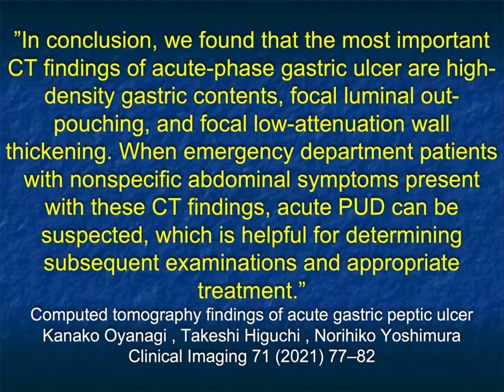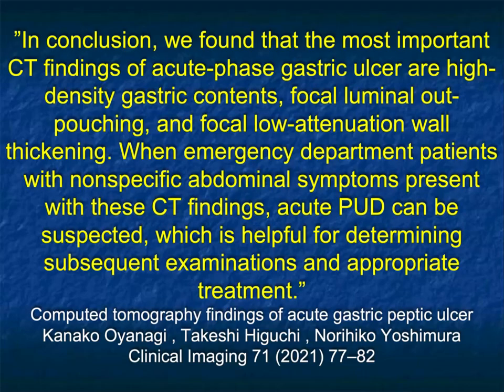In conclusion, the most important CT findings of acute-phase gastric ulcer are high-density gastric contents, focal luminal outpouching, and low-attenuation wall thickening. Coronal views and cinematic rendering nicely show wall thickening and ulceration, making CT a very important tool in evaluating these patients.